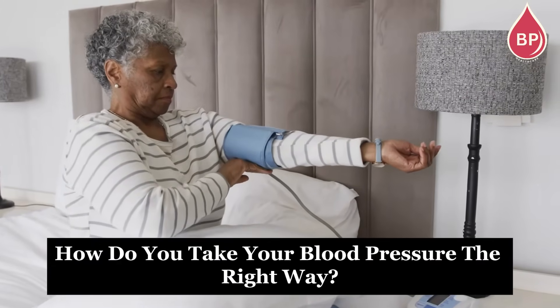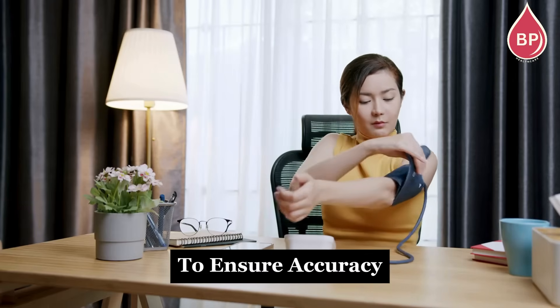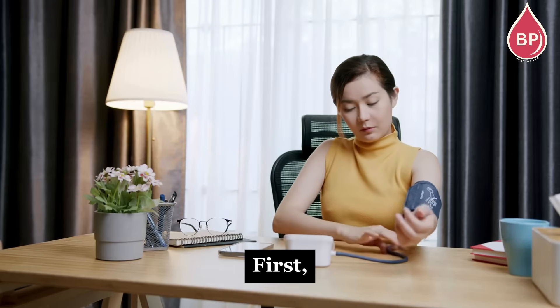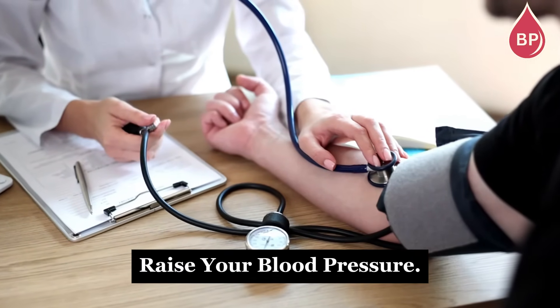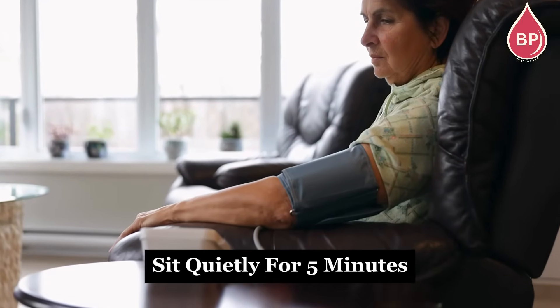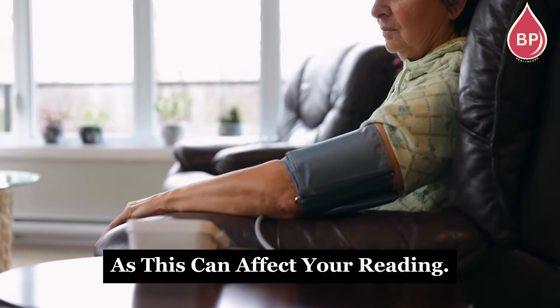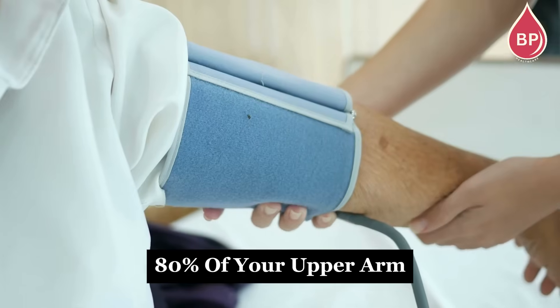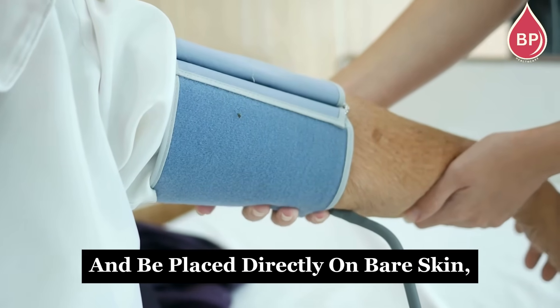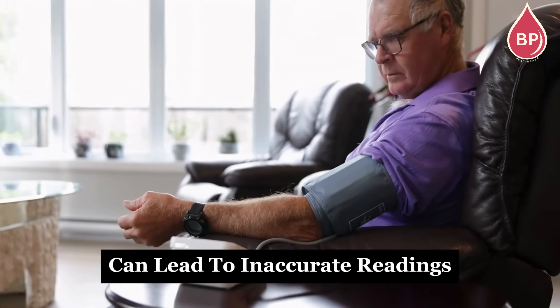How do you take your blood pressure the right way? Getting an accurate blood pressure reading is crucial, and small mistakes can lead to misleading results. To ensure accuracy, follow these key steps. First, avoid caffeine or smoking for at least 30 minutes before measuring, as both can temporarily raise your blood pressure. Next, sit quietly for 5 minutes before measuring — avoid any rushing or last-minute activity. Make sure you're using the right cuff size; it should cover at least 80% of your upper arm and be placed directly on bare skin, not over clothing. Remain still and quiet while measuring, as talking or moving can lead to inaccurate readings.